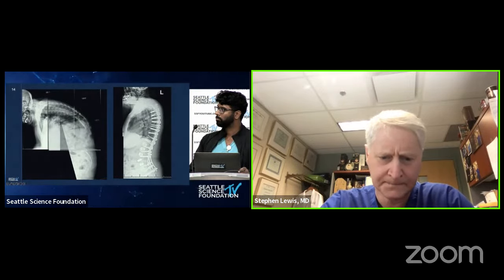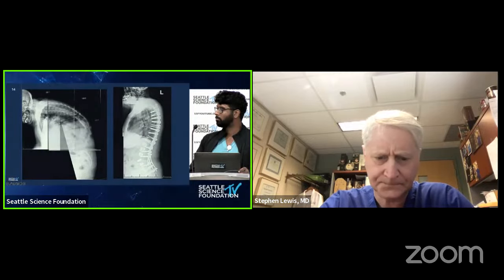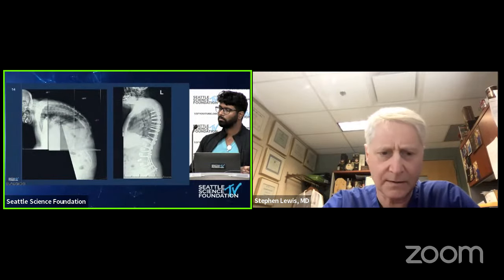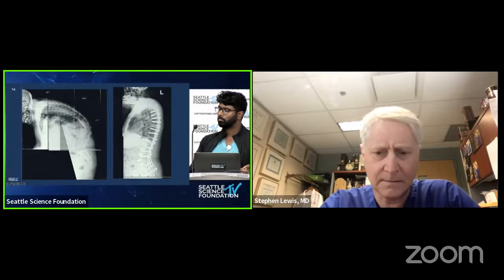And then I know you're going to give an excellent talk on some of these issues, but when you see a case like this, you automatically say, okay, this patient is going to get PJK. What are your tips or tricks to avoid PJK or drop head syndrome in a big case like this?